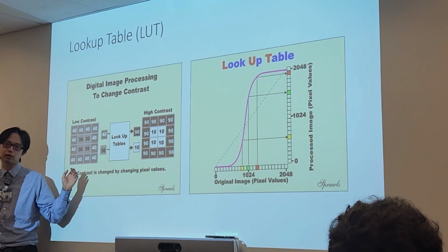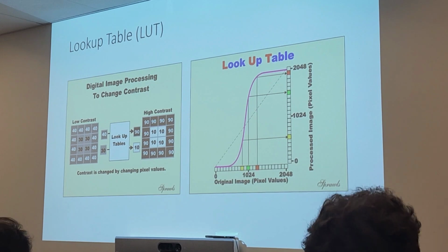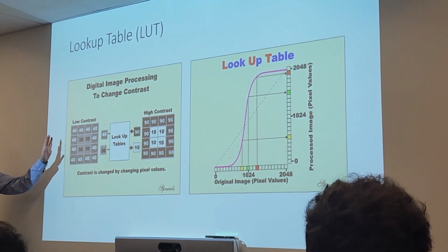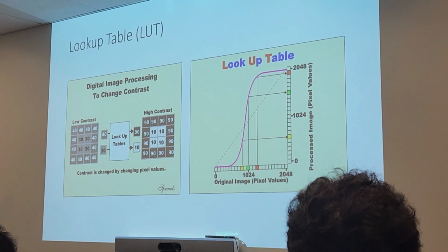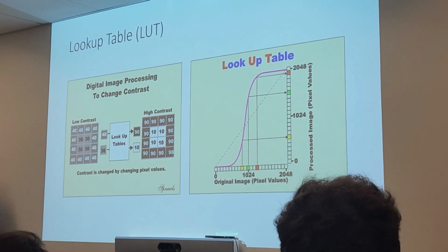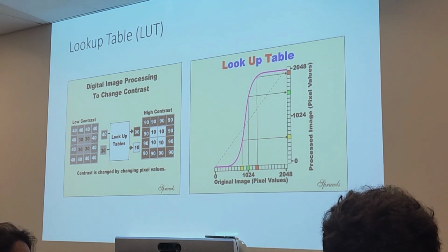All right, so any questions about the lookup table or automatic rescaling? Are we okay with this concept? And when does this take place? Pre-processing, right? Before the final image pops up. CR cheats, it shows you that preview, right? So we don't count the preview. It's before the actual final image pops up. So that's why in CR it always looks like a lot more gray. Okay, correct.